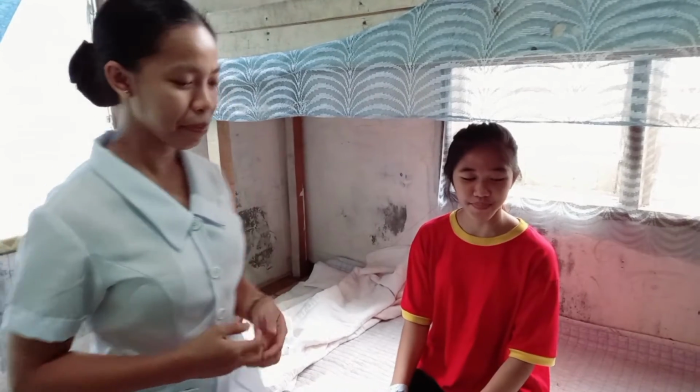Okay, sige ma'am. After explaining the procedure, we will now place the patient, or assist the patient, in supine position or in a Fowler's position since they will permit the arm to be used and a good body alignment.